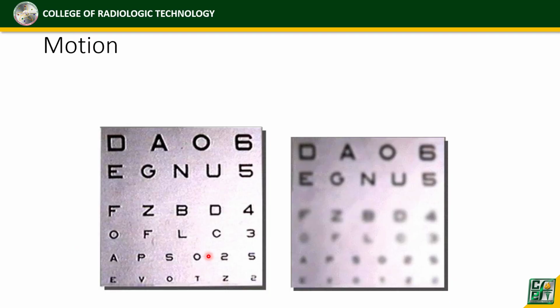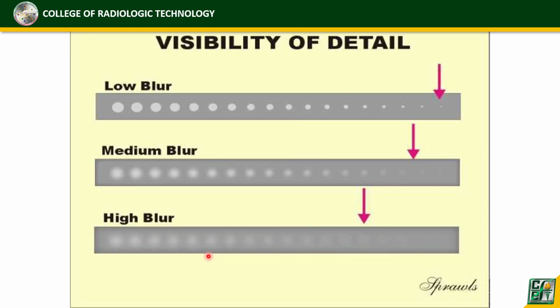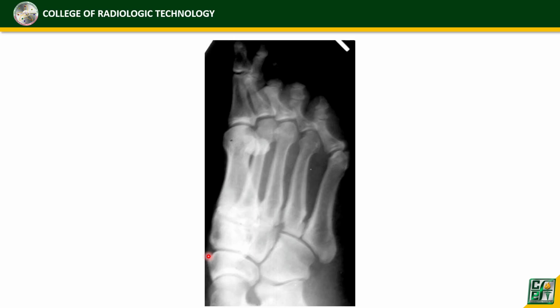Kapag gumalaw, may unsharpness. Okay? So visibility of detail, okay? Low blur, okay? Low blur, katanggap-tanggap yan. Medium blur and high blur, of course, that is a no-no for radiography. Okay?